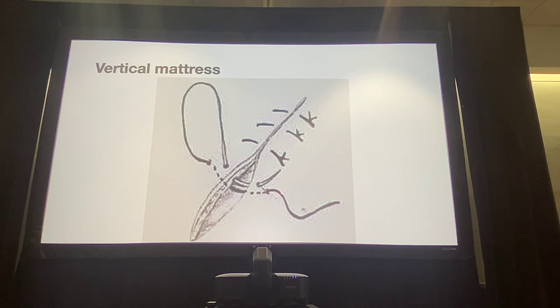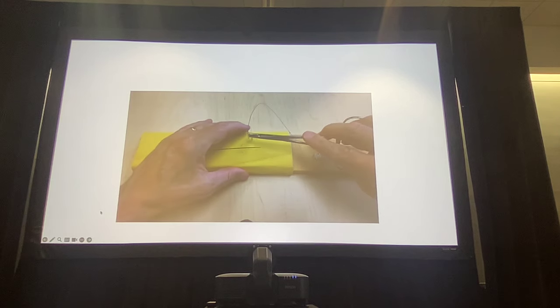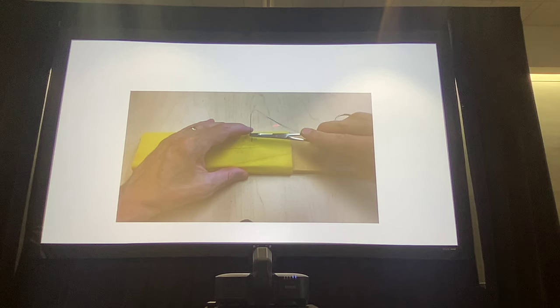You're going to take a bite here, and this time I want you to take your bite farther away than you were previously. Come around here. Then you're going to turn the needle around and take another bite in the same plane as you just went. So take a bite here first, go across, exit, take another bite in front of the exit, go across, and then exit in front of your original placement of the needle. It'll make more sense on the video. And same thing, you should feel the tissues coming together, because the intent is to pull the edges together. Start farther away than you have been for this one.